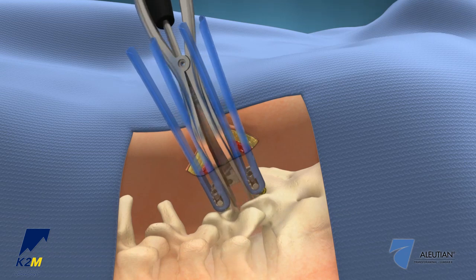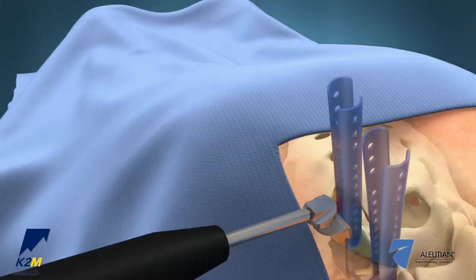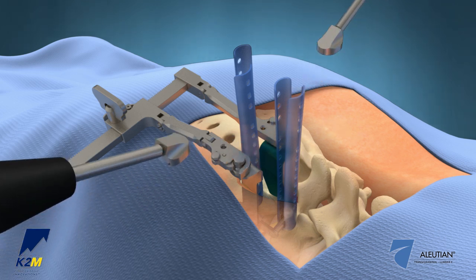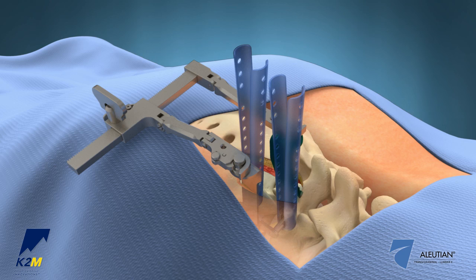Distract the disc space using the angled distractor. Engage the retractor frame to the quick-connect features of the retractor-distractor blade and the medial blade. Ratchet the frame to the desired position to sweep the tissue medially over the facet.